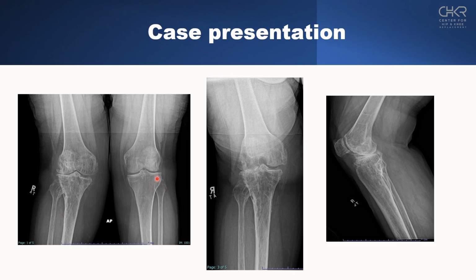Radiographs show also a clear difference in the degree of bone quality in the tibial metaphysis. If we look at the left side, we can see nice calcifications, and here we can see a graying or washing out of the bone stock in the metaphyseal diaphyseal region. So these issues, the loss of tibial height, as well as the alteration of posterior slope and the loss of bone mass in the tibial metaphysis, will present key reconstructive challenges in dealing with this associated valgus deformity.